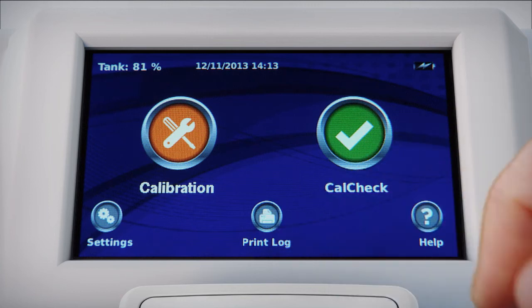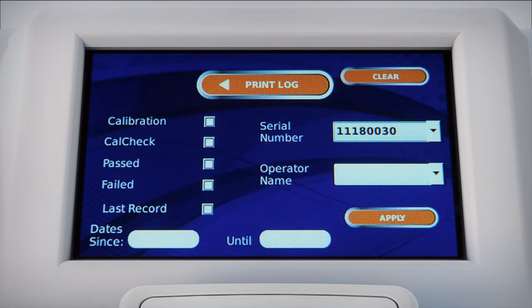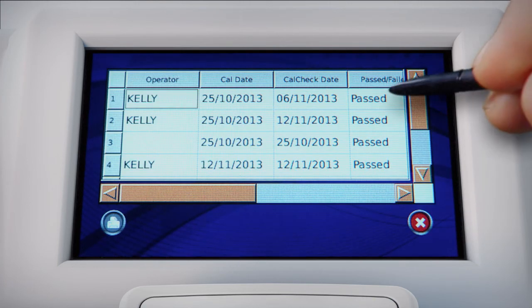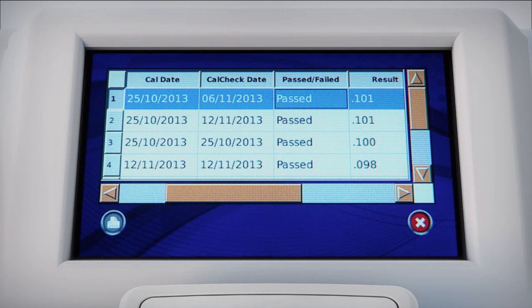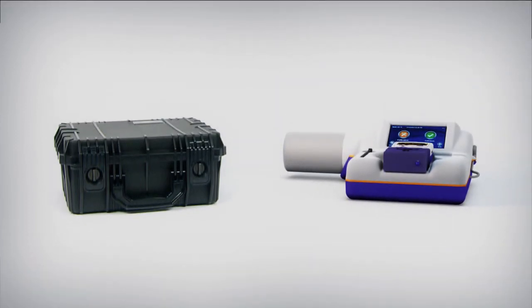Instrument serial numbers are read and stored with each calibration event. The on-board print log archives all cal checks and calibrations across any number of instruments in both the cal station and in your instrument. The EZ-Cal is available in both fixed station and mobile configurations for true versatility, supported by battery or conventional power options.